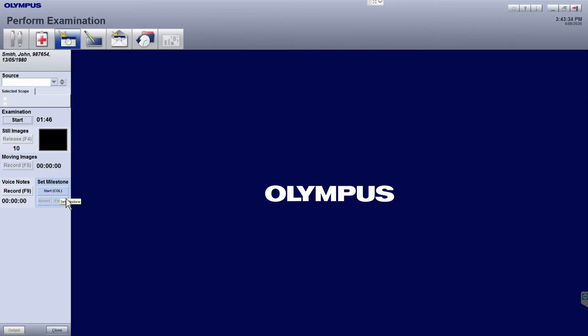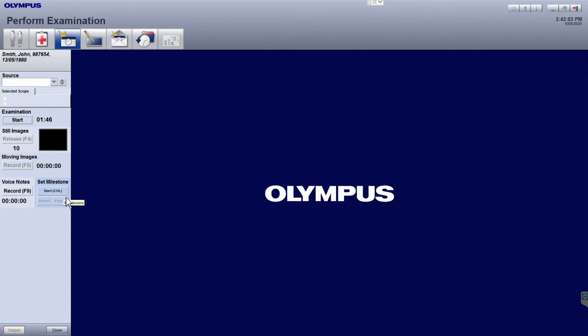The Milestones function is available under the Set Milestone heading, and our default setting allows the capture of three key timestamps. Press the Start button under the Set Milestone heading on insertion of the scope. If you haven't started the exam, pressing this button will also automatically start the examination at the same time.